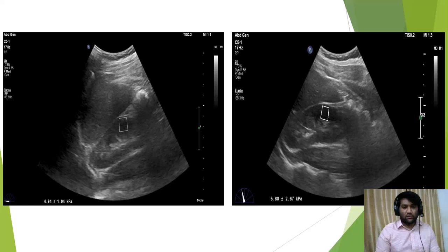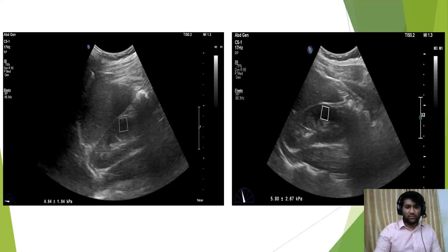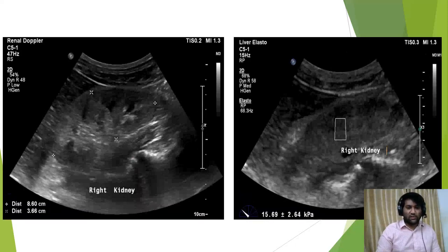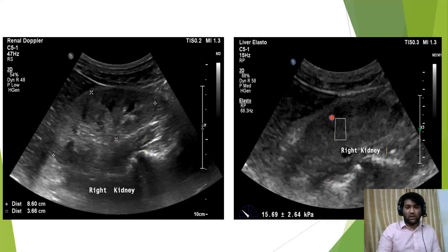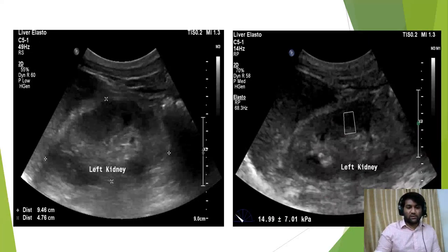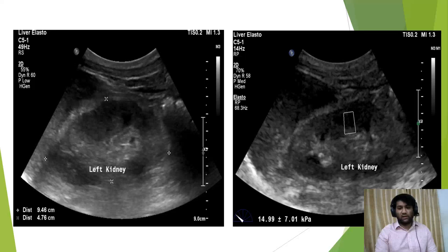Here we can see how SWE is used to measure Young's modulus, expressed in kilopascals — this is in a control subject. This next image is in a case subject where first 2D ultrasound is used to measure the kidney, and then shear wave elastography is used to measure the renal cortical stiffness. The following picture shows the same patient on the other side.